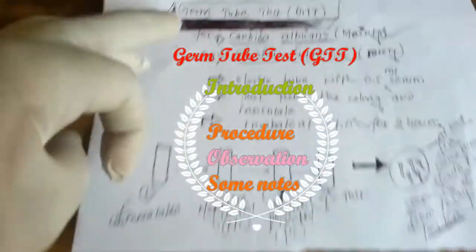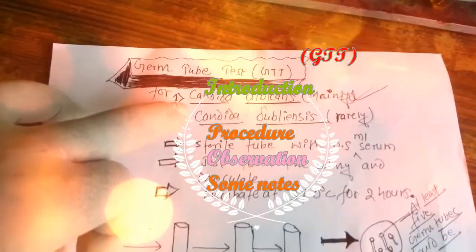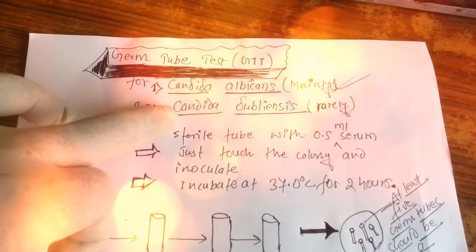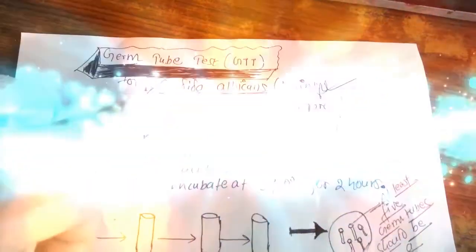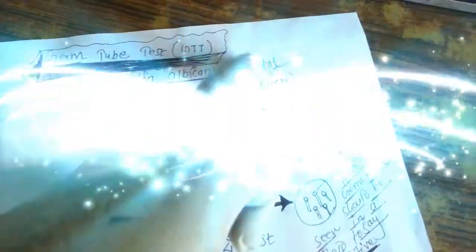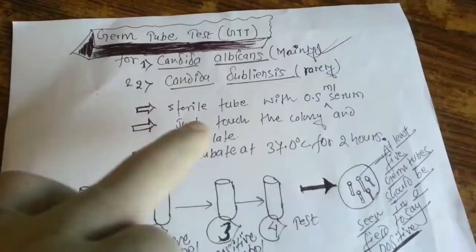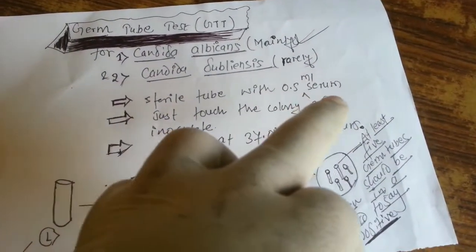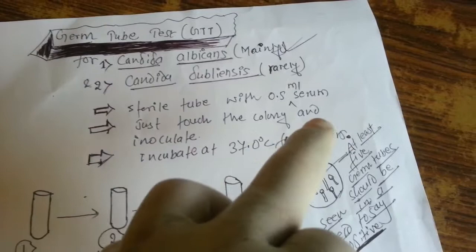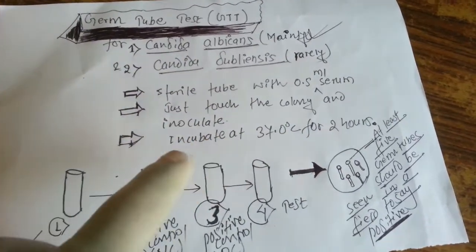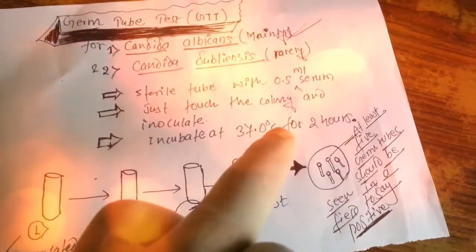Hey everyone. Today I am going to deal with Germ tube test. Introduction. This procedure is used for presumptive identification of Candida species and also called Germ tube test, in short GTT. The demonstration of Germ tube is also known as Reynolds Browder Phenomenon.